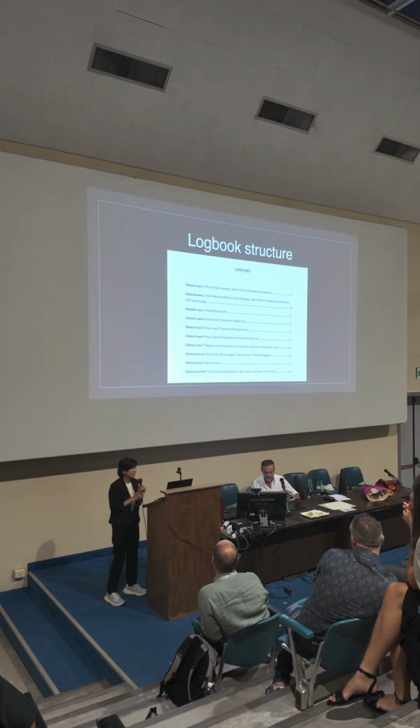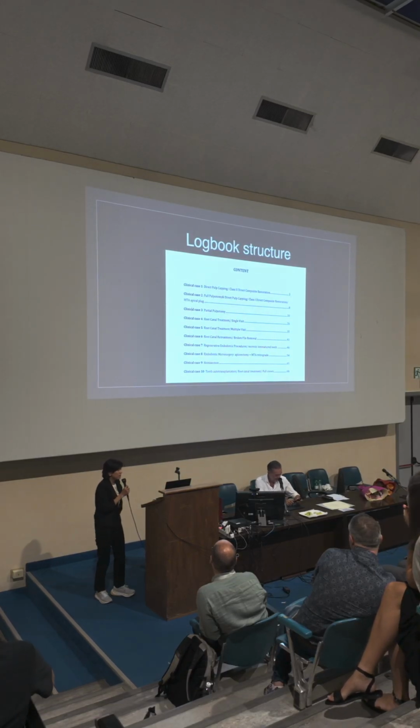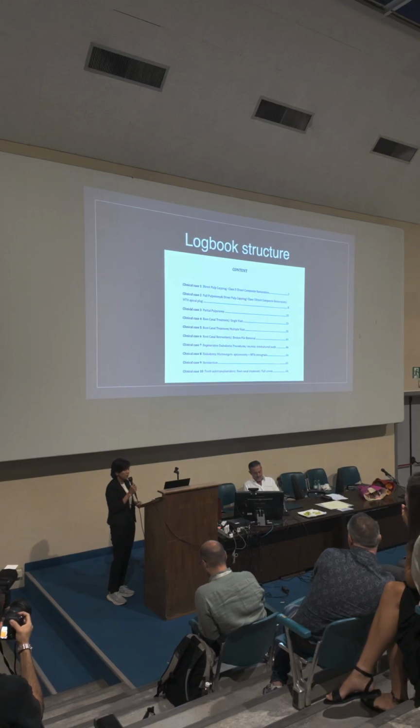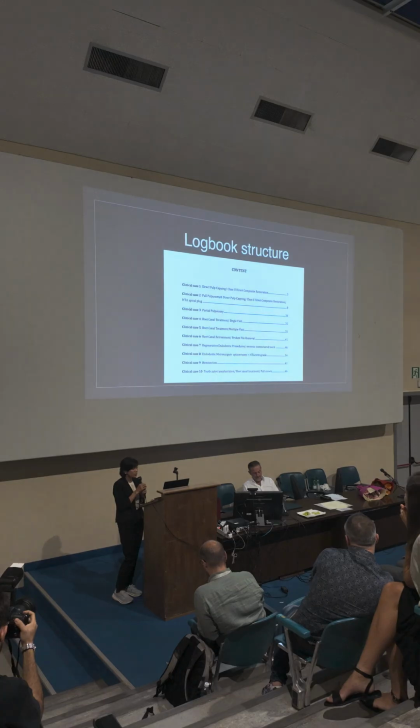Let's take a look at my logbook structure. I try to include almost all the endodontic therapies inside my logbooks, ranging from vital pulp therapy to endodontic surgery. And I try to pick 3 of them to show you today.